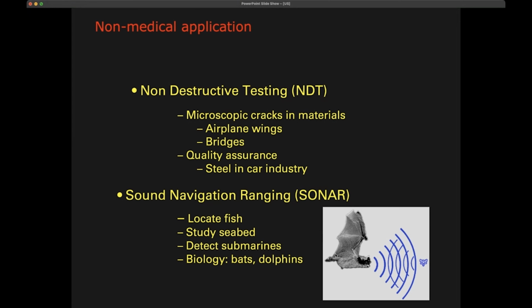And we also know that dolphins, for example, are also using this. One of the things that, by studying bats, for example, you can also see is that bats use several imaging techniques. As we will see later on, there are different ways to do ultrasonic imaging. And one thing is to really try to make a tomography. So as we said, like a cross-section, like a cut through an object in order to look at the internal structure of it. So bats are also using imaging.